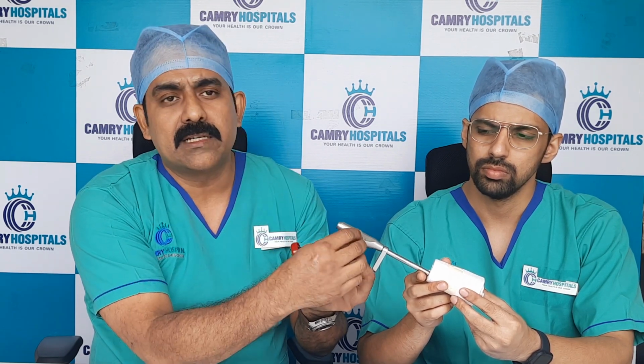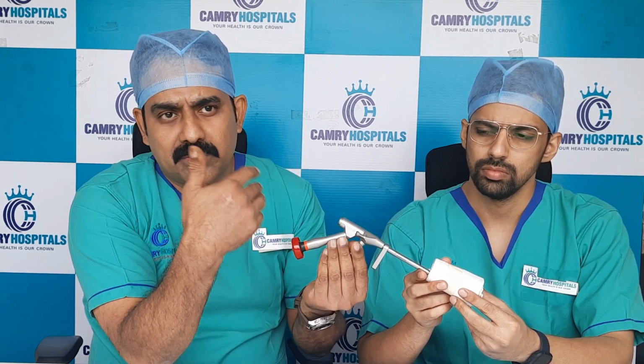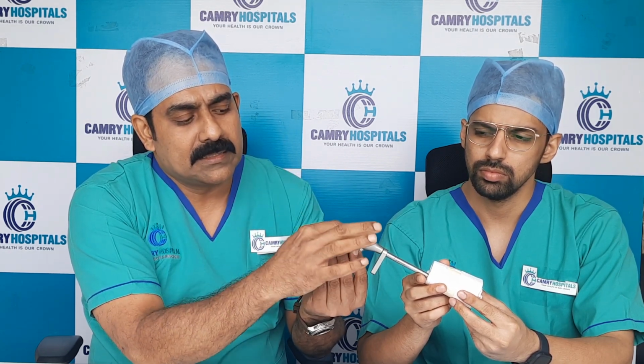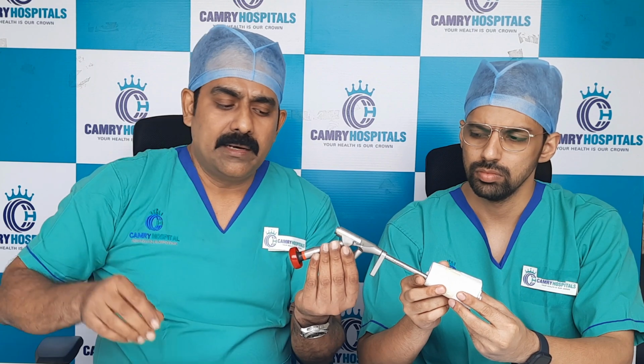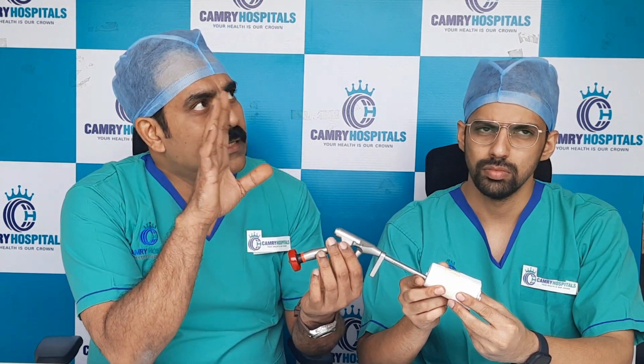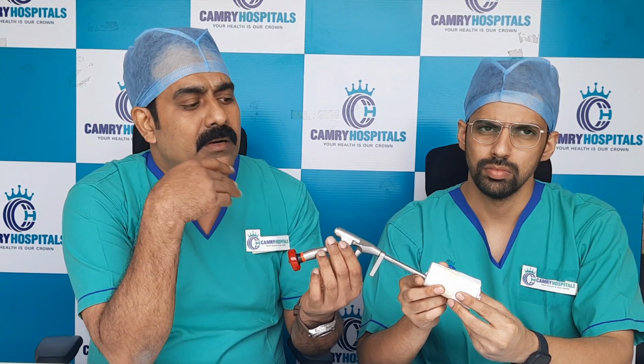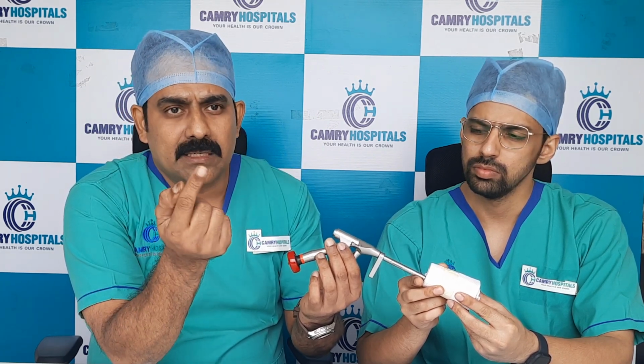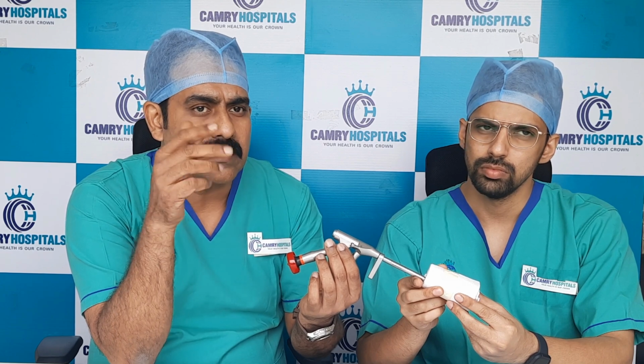Water channels come in this, saline irrigation comes. To cool the tissue and hydrate the tissue, saline infusion goes in. Then once we are ready, we are seeing everything under the camera. We are not looking into the patient, we are looking at the screen and doing the surgery. So it's just surgery through a 7 or 8 mm incision.